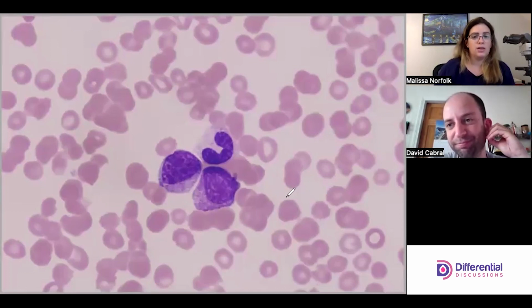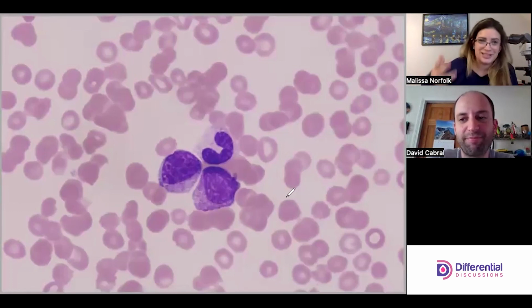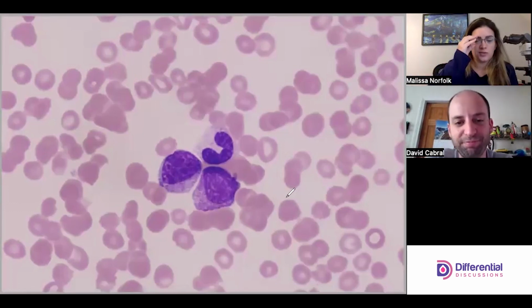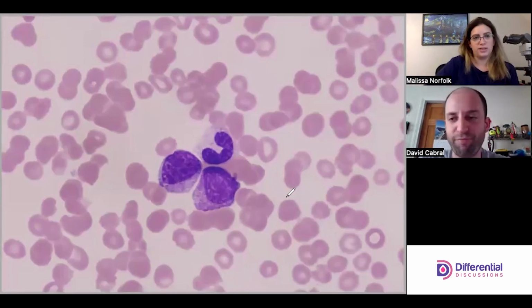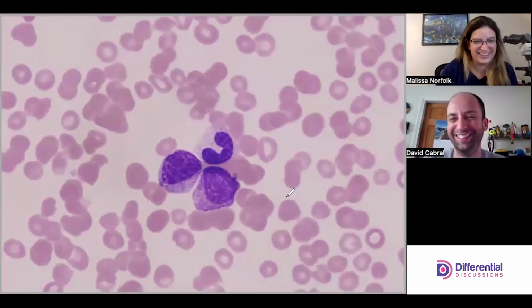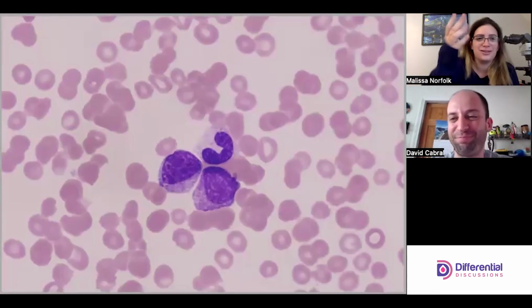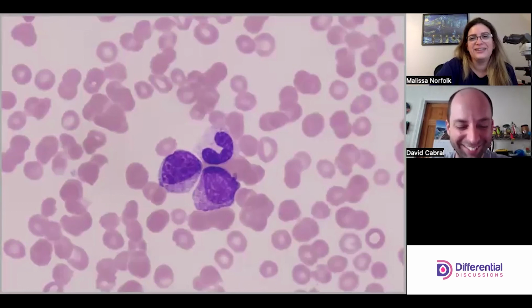It seems like this malignancy has a lot of dysplasia, and not all AMLs have a lot of dysplasia. Right. So that's why in a lot of the AML slides, you can see consistent, oh yeah, that's myelo, oh that's meta, okay, yeah, that makes sense. Mm-hmm. But when you have a lot of dysplastic features, that's when you get Dave and I just being like, nah. Gross. See, we think it's gross just like you guys do. Definitely. But it's all good.